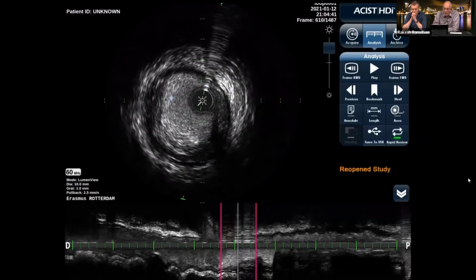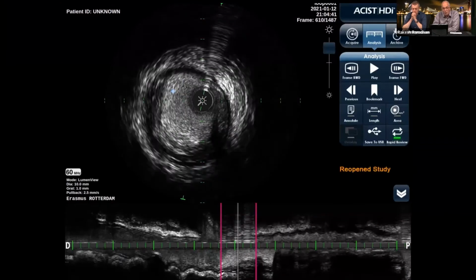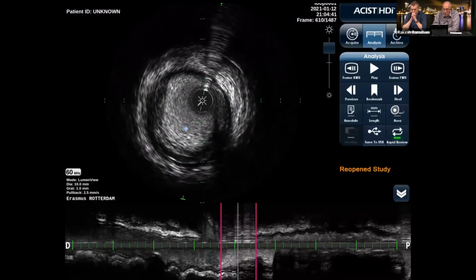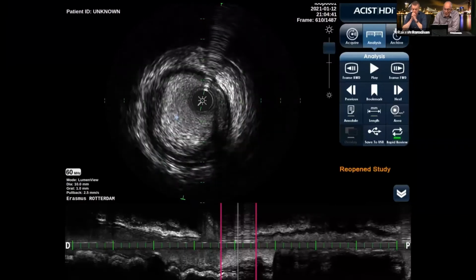However, this is not acute thrombus, this is non-moving blood, and you can compare it with spontaneous contrast recognizable in your left ventricle ultrasounds. And for ultrasound, non-moving blood and platelet aggregation, that is the first sign of thrombus, is the same. It's completely inhomogeneous, so a lot of reflection.